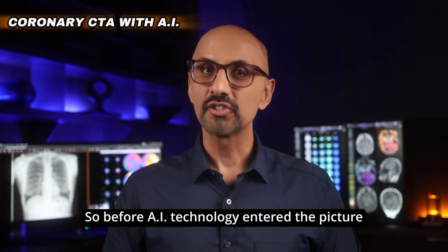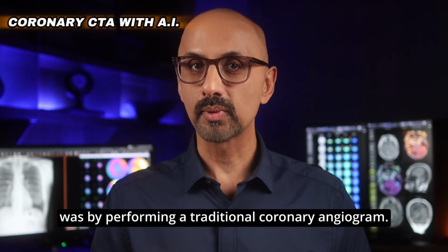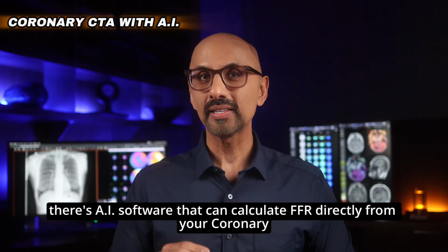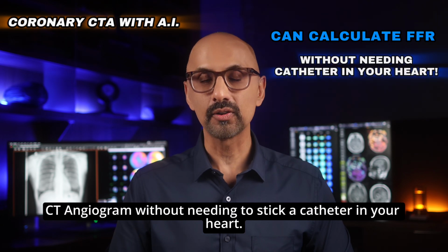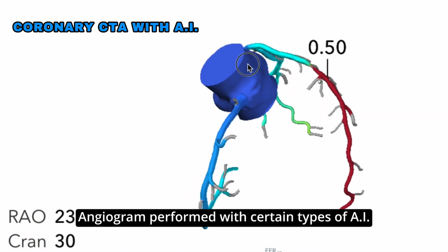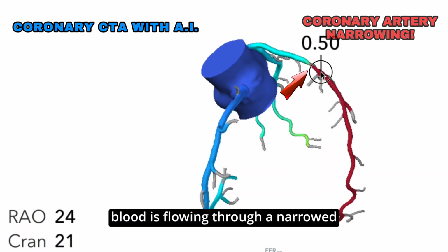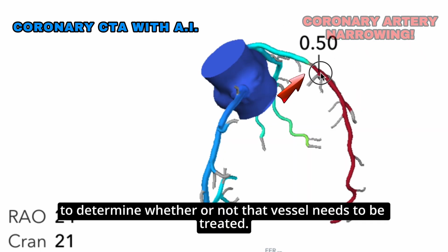So, before AI technology entered the picture, the only way for doctors to measure that important FFR value was by performing a traditional coronary angiogram. But today, there's AI software that can calculate FFR directly from your coronary CT angiogram without needing to stick a catheter in your heart. In other words, a coronary CT angiogram performed with certain types of AI software can give doctors a quick and non-invasive way to see how well blood is flowing through a narrowed coronary artery to determine whether or not that vessel needs to be treated.